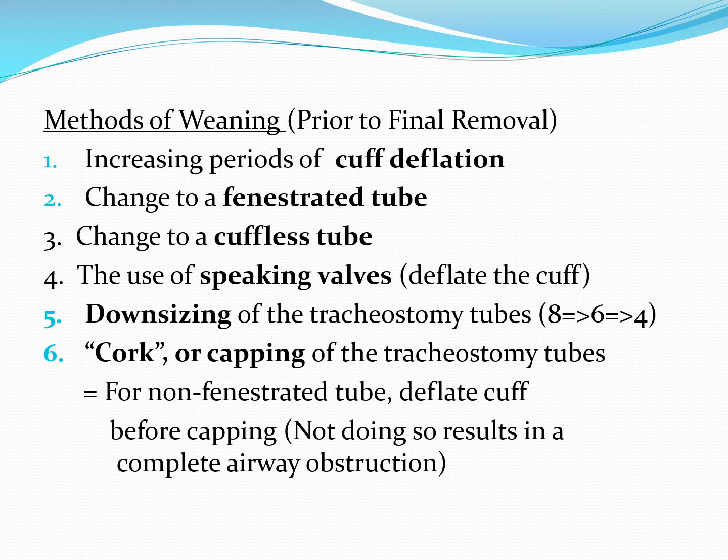Use of speaking valves, deflating the cuffs, and speaking valves, I know I alluded to that in other slides in this presentation, but basically many of them are one-way valves that allow the patient to breathe in through the tracheostomy, but when they exhale, it doesn't allow them to exhale through it. Instead, they would exhale upwards through the vocal cords and allow them to actually phonate.